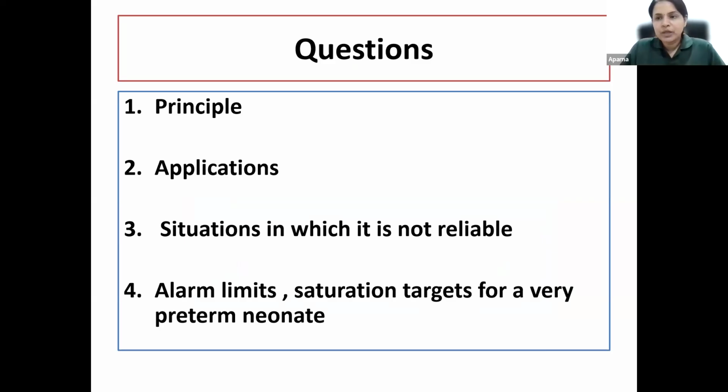So in the NICU, we have two different types of monitoring devices. One is a multi-para monitor, the other is the pulse oximeter. Now, a multi-para monitor is a monitor that gives us multiple parameters such as the heart rate, the rhythm on the ECG. It helps us to know the saturation. It helps us to know the non-invasive blood pressures. We can also install a module for knowing the invasive blood pressures. Temperature module can be added to the multipara monitor. Respiratory rate can be inferred from the ECG leads. So we can have some additional parameters also based on the requirement.